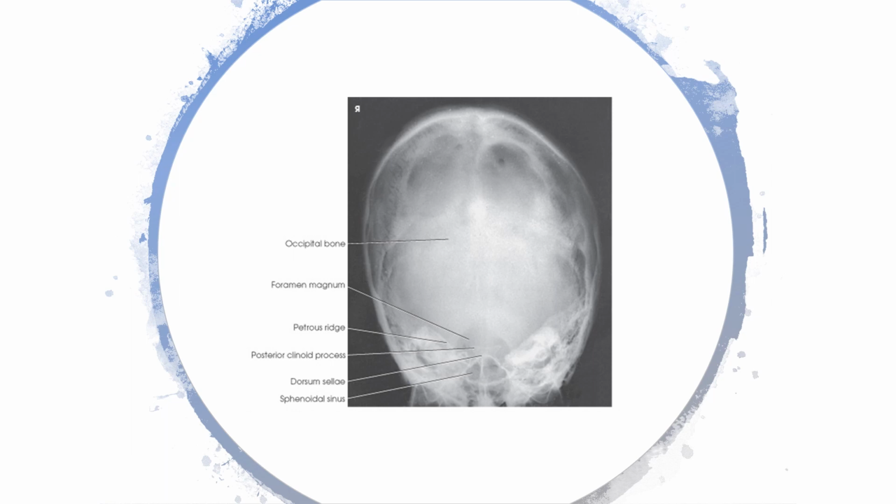The Haas method features anatomically, as far as what's displayed on the image receptor, everything that the Towne projection displayed, but also we now get the sphenoid sinuses in between the petrous pyramids, and you can see that indicated. It's immediately inferior to the dorsum sellae. Okay, so we still have a foramen magnum, we still have the dorsum sellae.